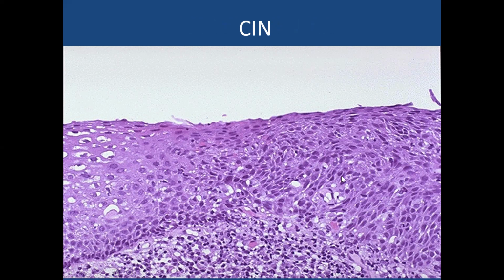It is real histology. So this is tissue, and you can see the normal arrangement, of course, not very normal because you can see koilocytes here. But you can see that this arrangement here is a bit, look at here. You see that now? Do you see that now?